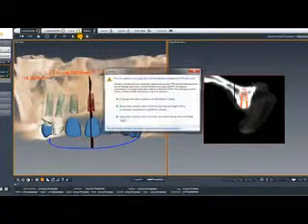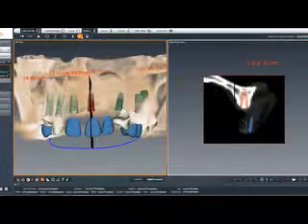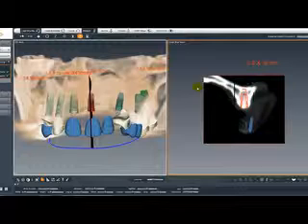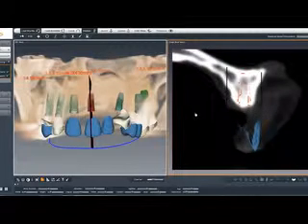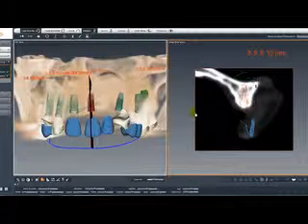I would have liked to put a 4.3 in there, but unfortunately we cannot. So I chose a 3.5 by 10 only because of the proximity to the nasopalatine area in here. Still, a 3.5 is better than nothing in terms of determining the AP position of these two anterior most implants that will be in here. So this will be a 3.5 by 10 millimeters.